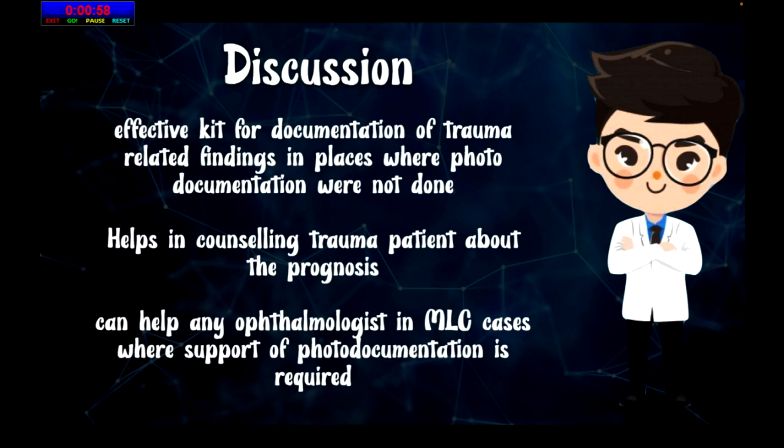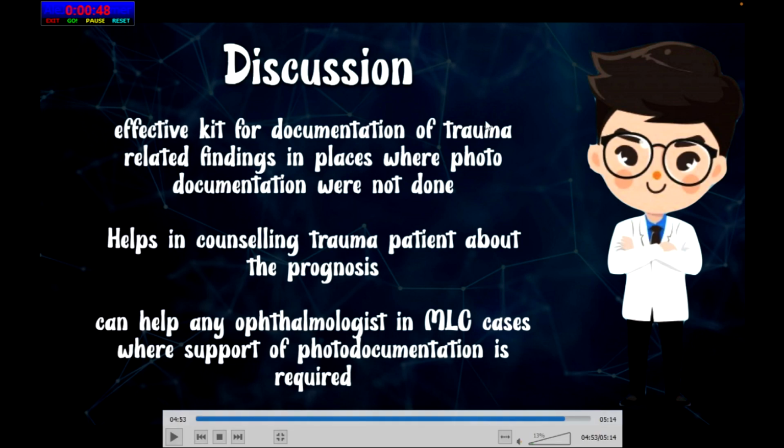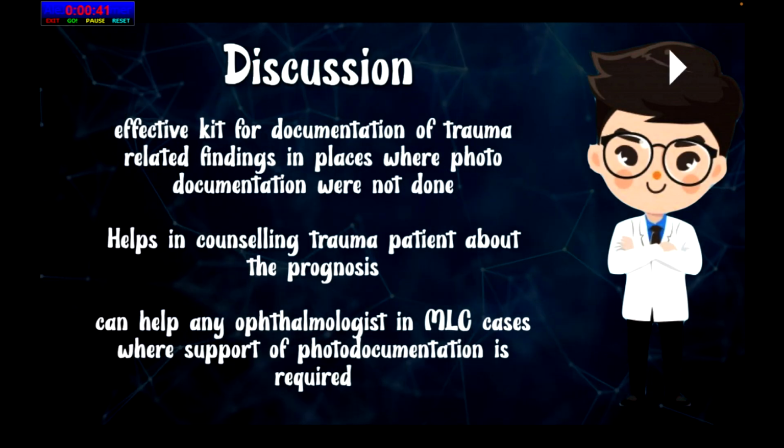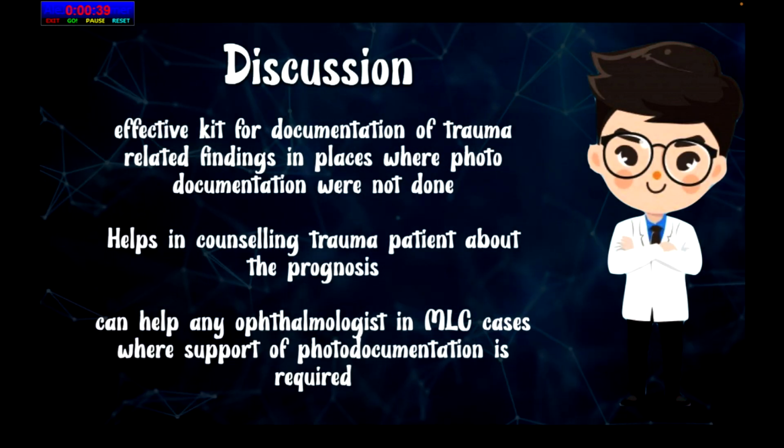And this kit is very effective for documentation of trauma related findings, especially where people are not able to take images of these. It helps in counseling trauma patients about the prognosis, and can also help in medico-legal cases when we have photo documentation in hand. It becomes very easy for us to prove our point.